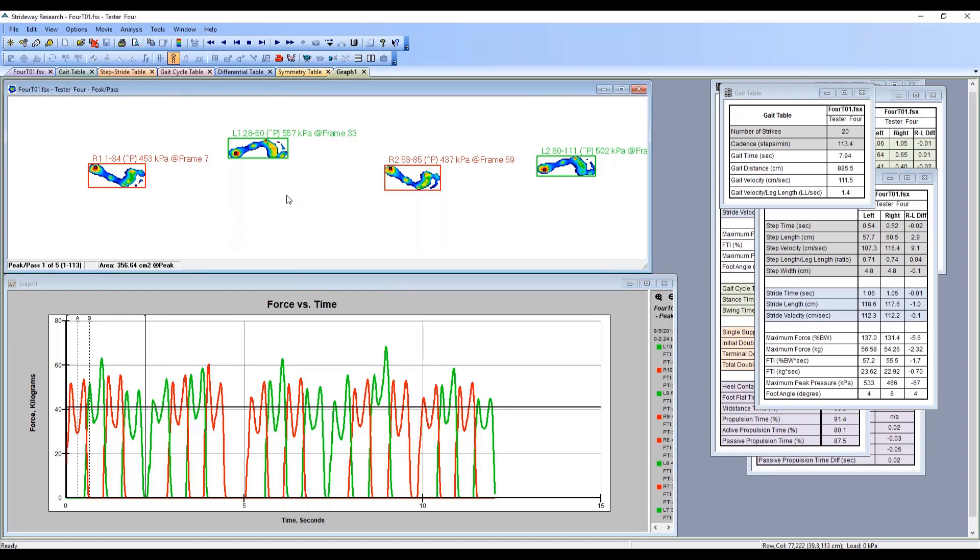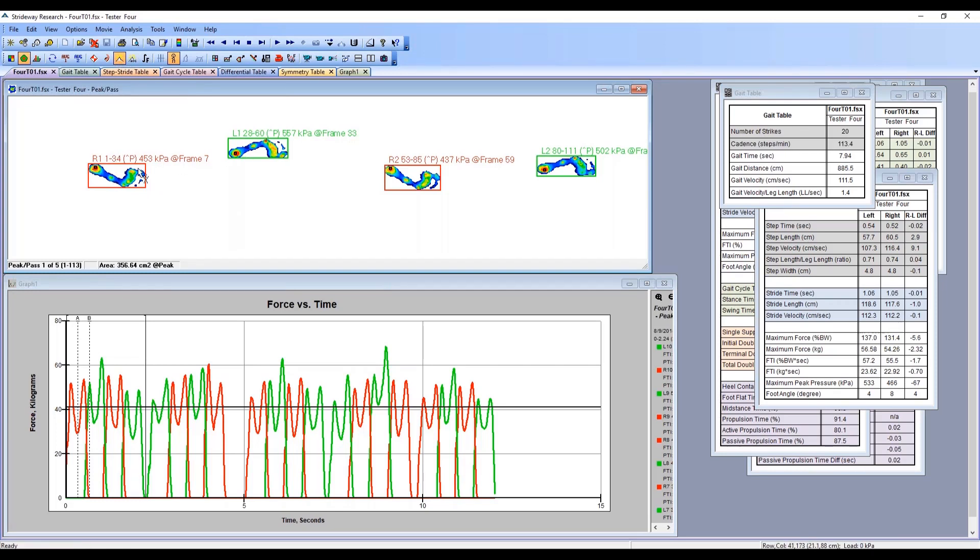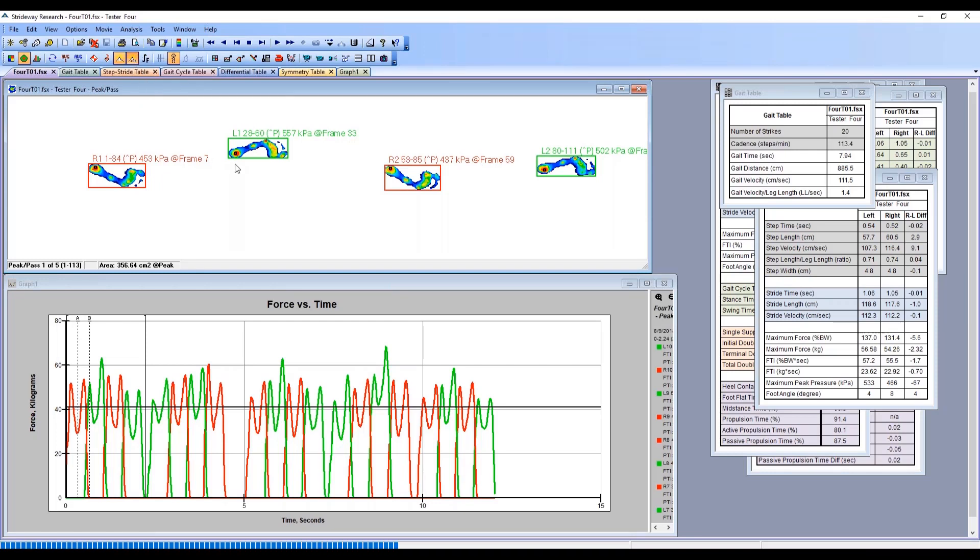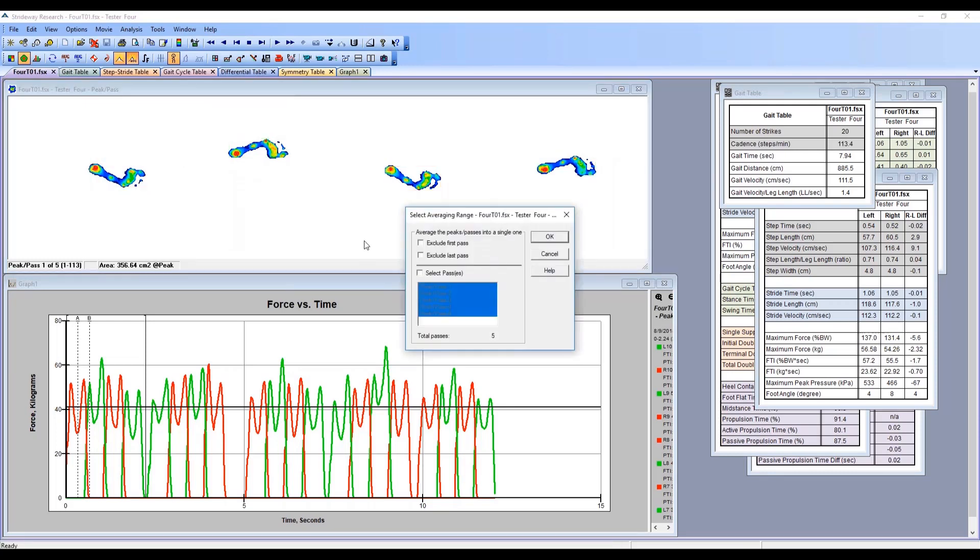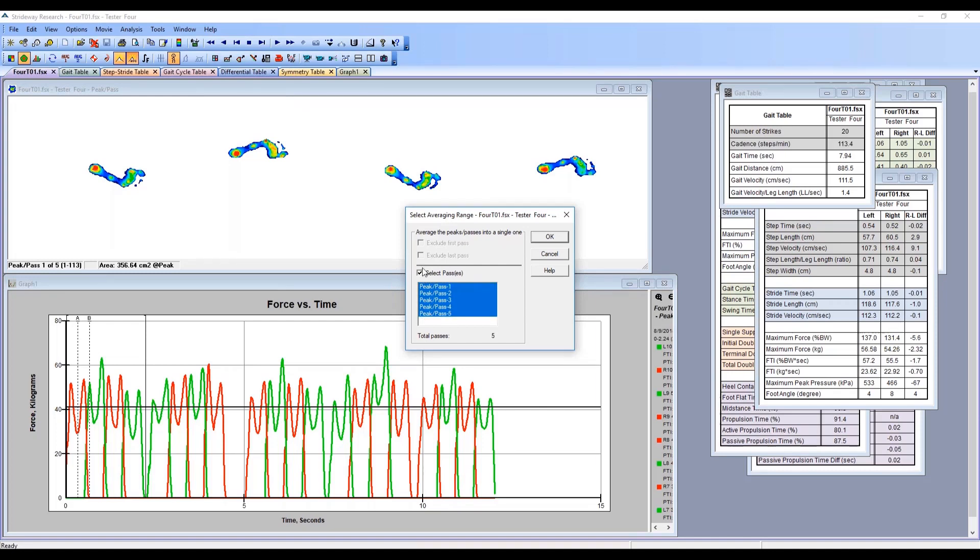We can use the ability to average the data. We're in peak stance mode right now, showing the peaks of each foot strike. If we hit average peak, you'll see that the software will take all of the passes. Here you have the choice of selecting only certain passes that you want included in your data, or you can select them all.